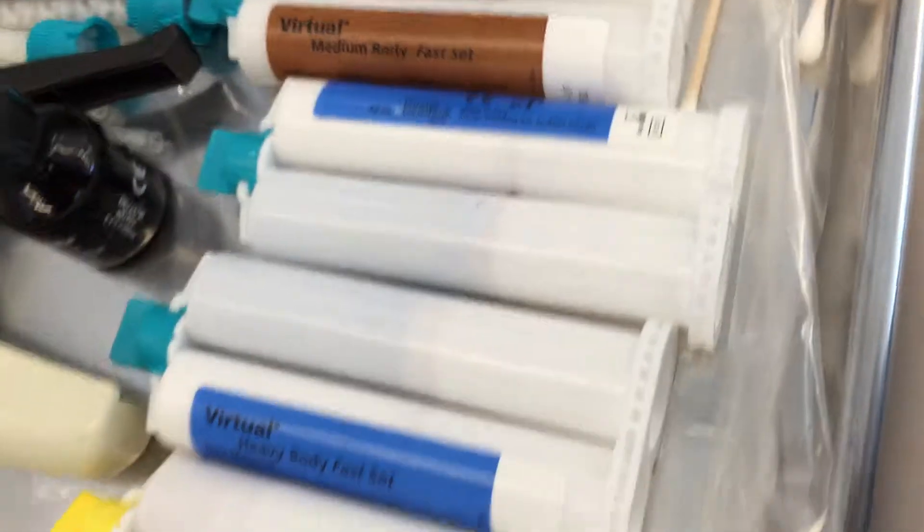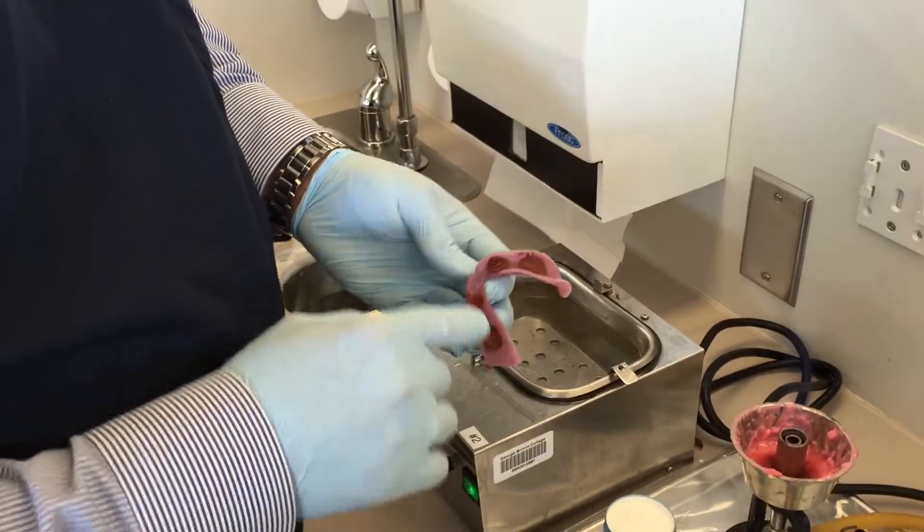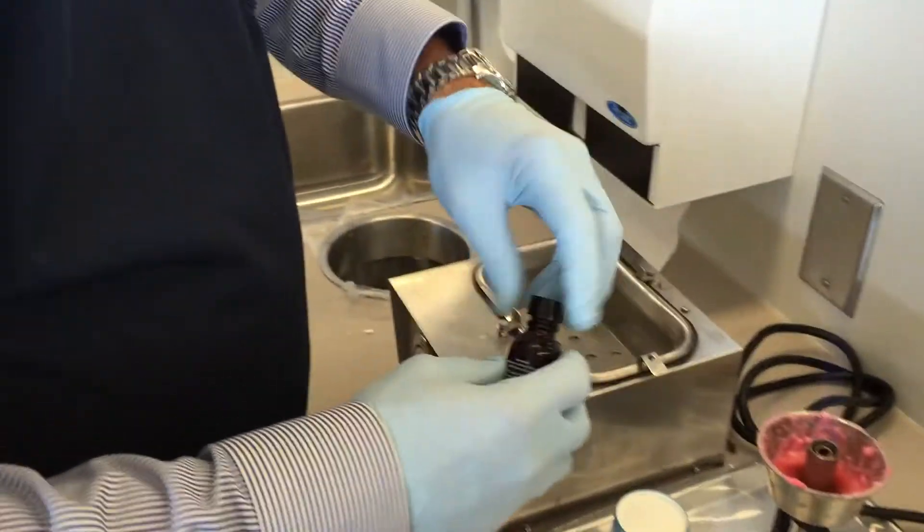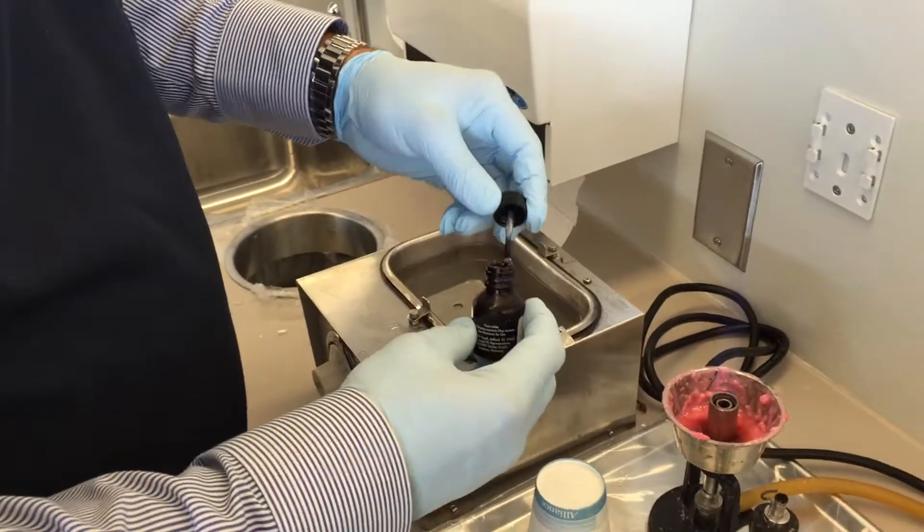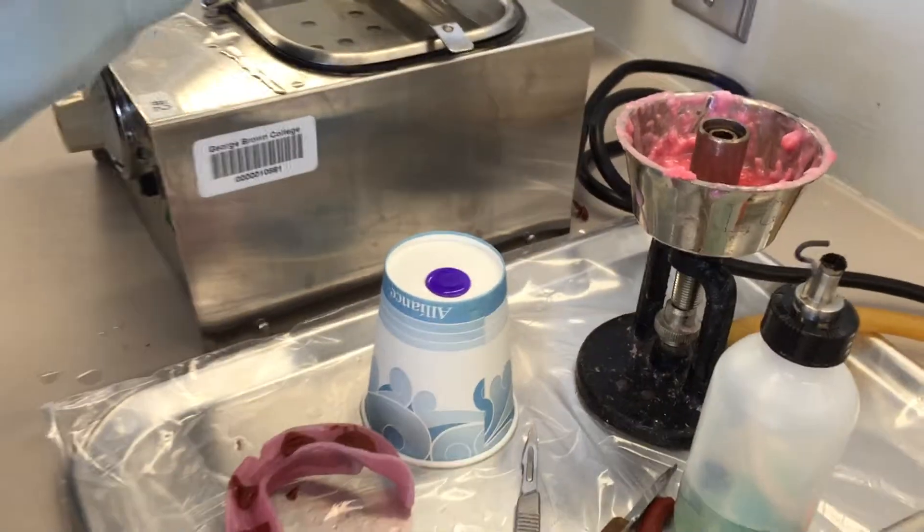But in order to make sure that the material adheres to the tray, I need to incorporate some adhesive. To prevent any cross-contamination, we're going to dispense a little bit of material on the back of a Dixie cup here.